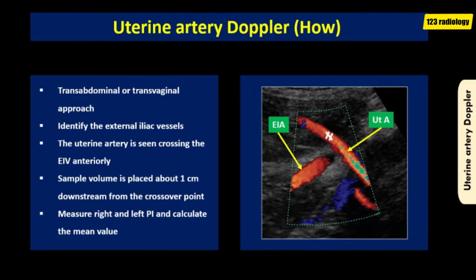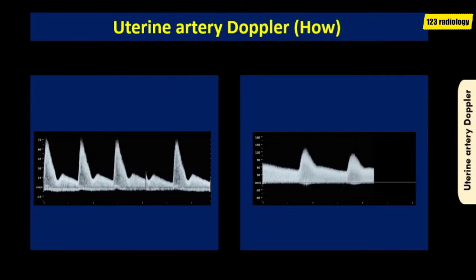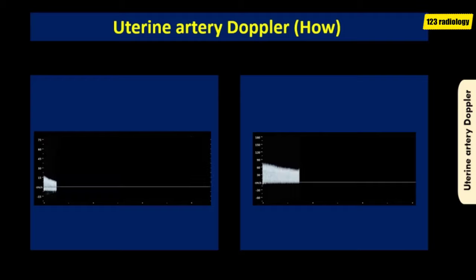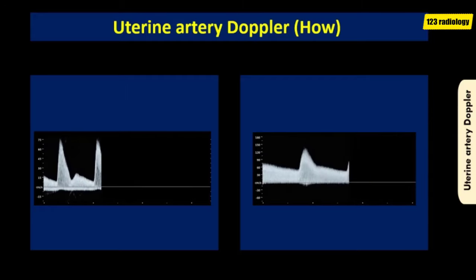How to perform uterine artery Doppler examination? There are two approaches: transabdominal and transvaginal. On the transabdominal approach, first identify the external iliac vessels. The uterine artery is seen crossing the external iliac vessels anteriorly. The Doppler sample volume is placed about 1 cm downstream from the crossover point. Measure the right and left pulsatility index and calculate the mean value. The two waveforms displayed differ — one obtained in the first trimester and the other in the late second trimester.